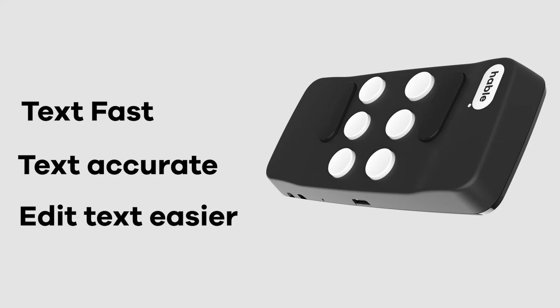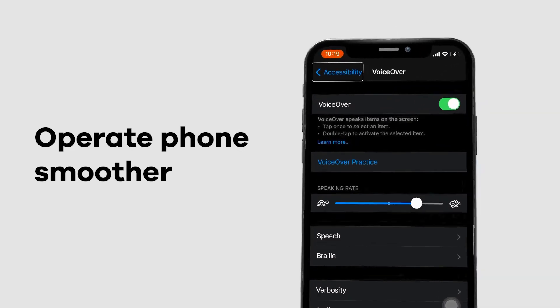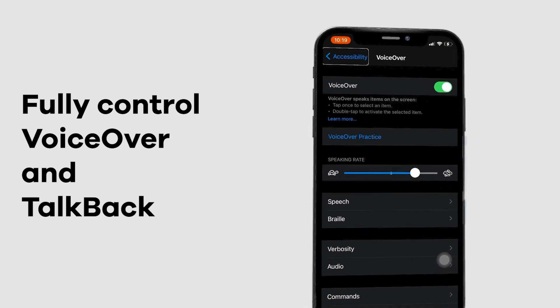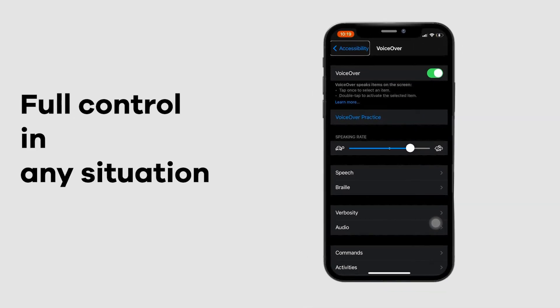With the Hable One you can edit text easier and operate your smartphone smoother. Hable One can fully operate VoiceOver and TalkBack, allowing you to keep your phone in your pocket, providing you with full control over your phone in any situation.